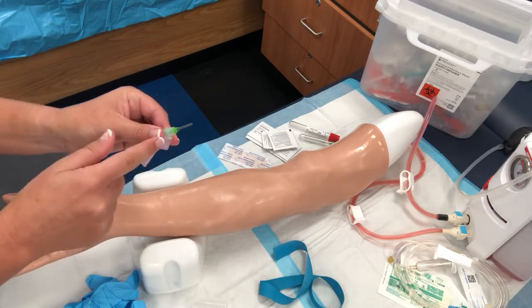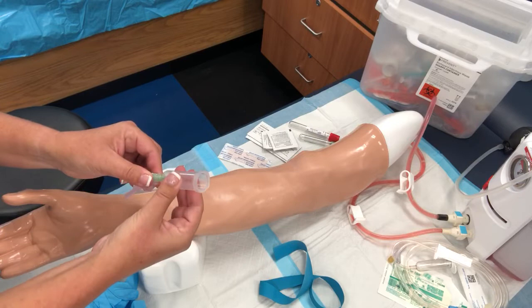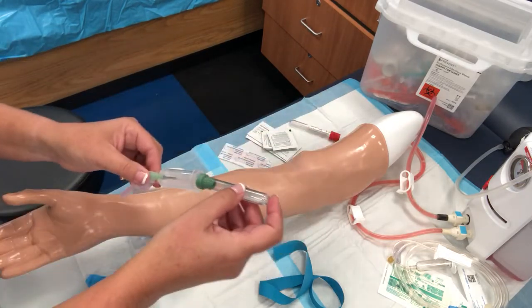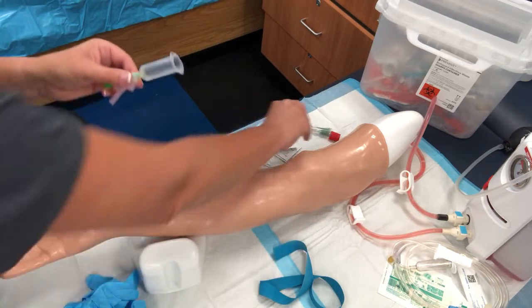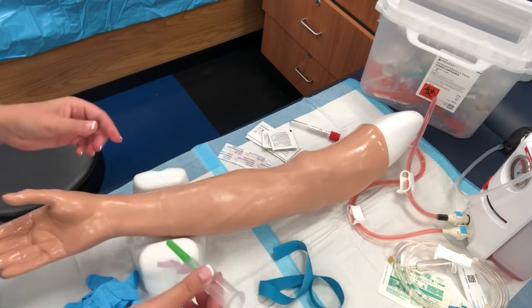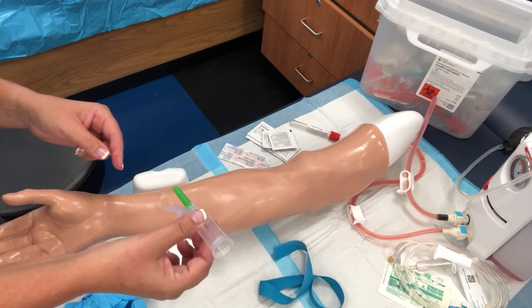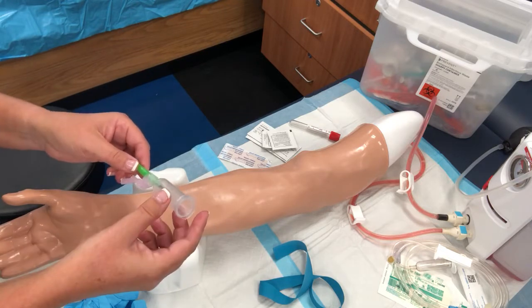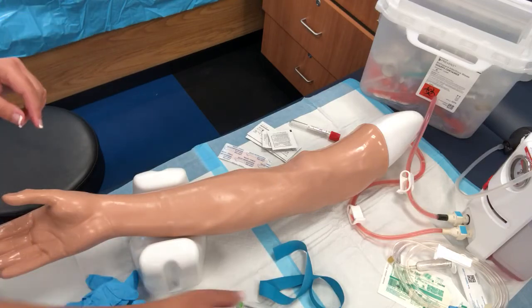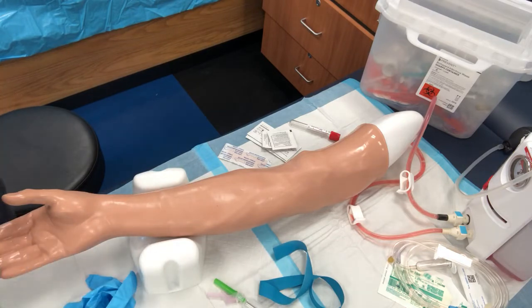It opens up and it will have a little stopper. Now the stopper actually gets screwed into your adapter, okay? And then into this is where you will eventually put in your vacutainers. This then becomes an entire device which will get thrown away. So all of this then goes into the sharps because in theory all of this was accessed with the patient's blood. So that's the adapter that you can go ahead and connect, lay it down. Again, hopefully this did not come off. It shouldn't have. Certainly don't recap your needles as I just did.